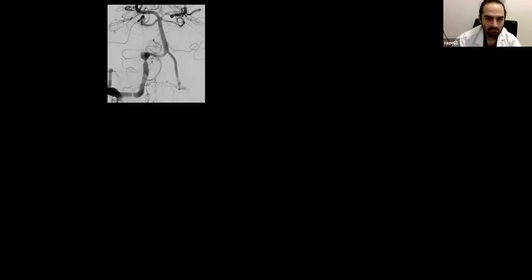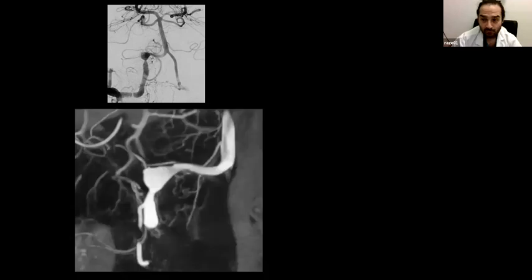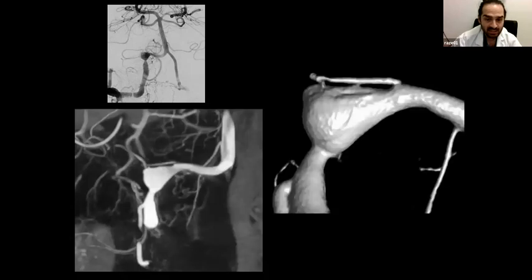So we decide to do the higher resolution imaging anyway. Here you see a PICA coming from here. And what we learn from that is that yes, there is a PICA. Then you see here the PICA origin. There is an anterior spinal artery that we can see here, okay. But there is also another little branch that comes just past the aneurysm here, and it would be like a cortical sort of cerebellar branch.